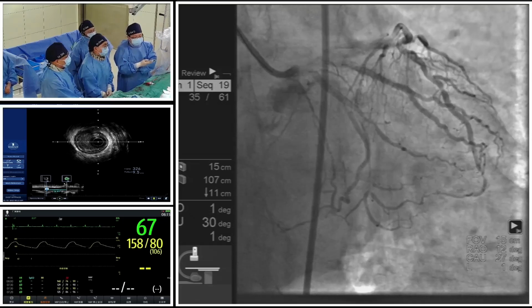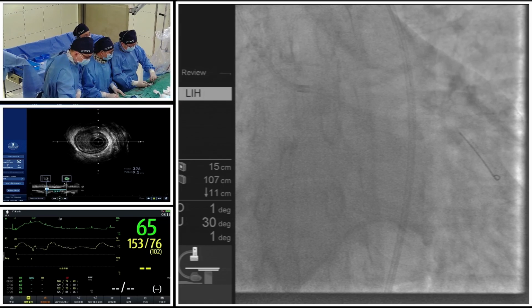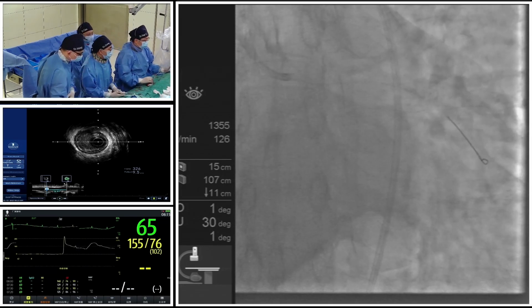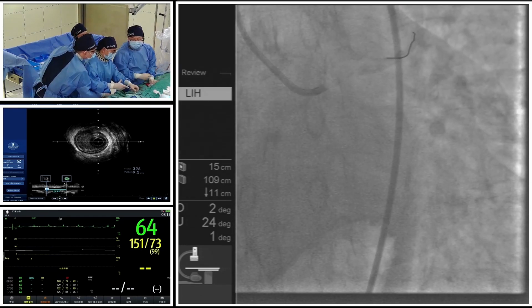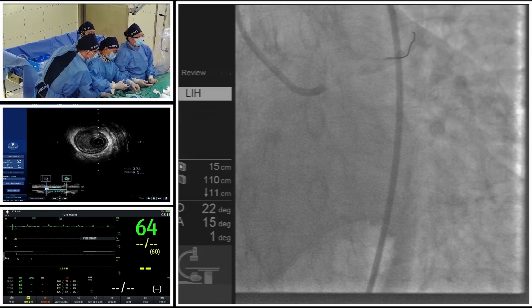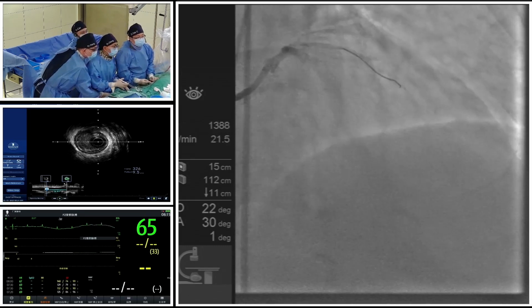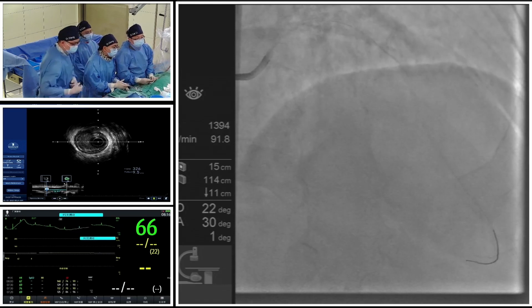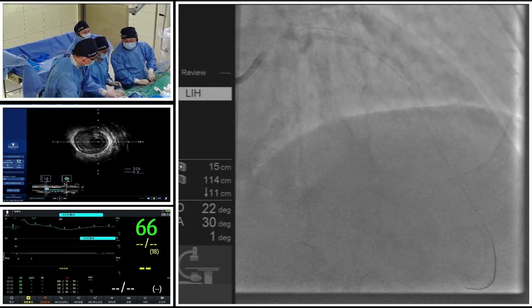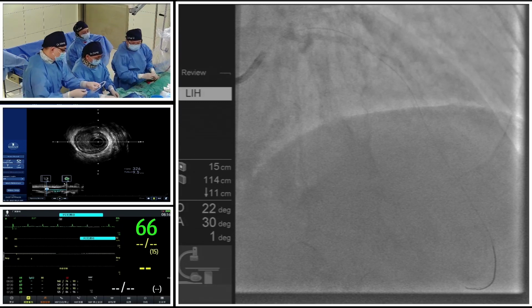stenting. Okay. For this patient, I think first this is a typical CHIP patient because it's a 3-vessel disease with a very severe calcification at the proximal part of the LAD. And also, I'd like to have a comment about the strategy for this patient. Of course, CABG could be one choice because there is a lot of plaque burden and long diffuse lesion. But if we pay more attention, we can see that all these severe stenoses are mainly distributed at the proximal part of the vessel.